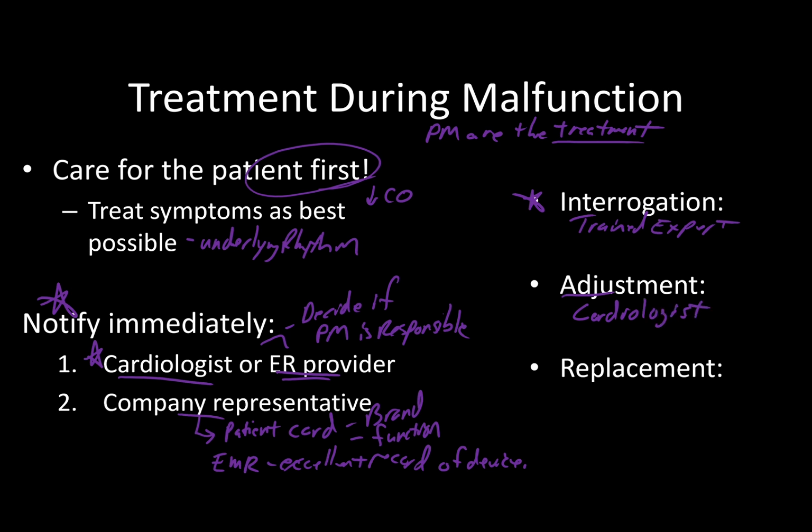They're the ones who are going to be able to read it and see what settings are best to help correct the problem. I've seen this done at the bedside a handful of times myself, that they'll have the device open, the patient's laying there, they'll hit a couple buttons, see what changes, make the adjustments, and then we'll write it out, see if that's effective or not, and maybe potentially change it again. It just really is a patient-by-patient scenario.